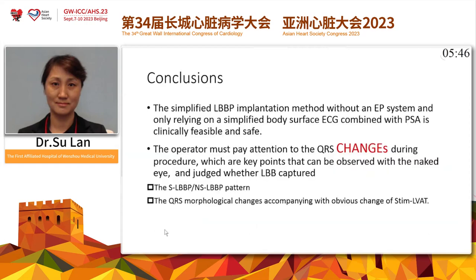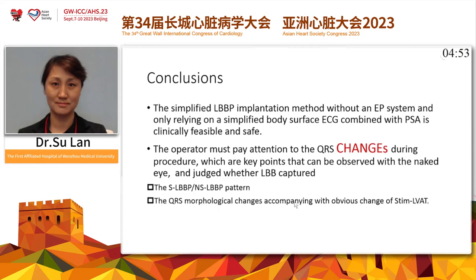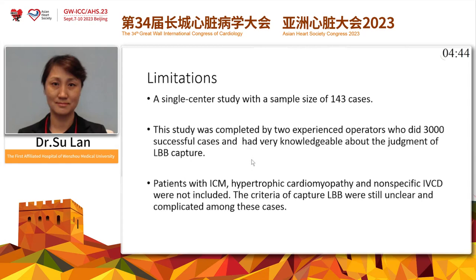This is the conclusion. This simplified LBB pacing implantation method, without an EP system and relying only on simplified body surface ECG combined with PSA, is clinically feasible and safe. The operator must pay attention to QRS changes during the procedure, which are key points observable with the naked eye for judging LBB capture — including the transition from selective LBB to non-selective LBB pacing pattern and QRS morphological changes accompanied by obvious change in LVAT.